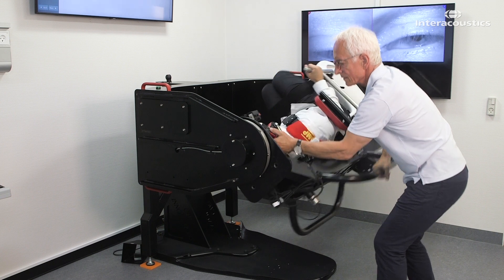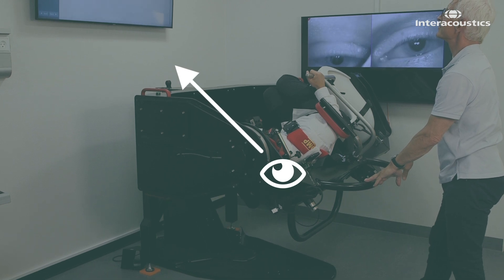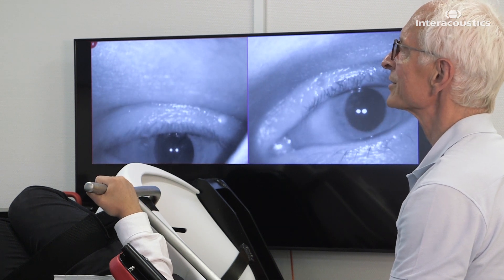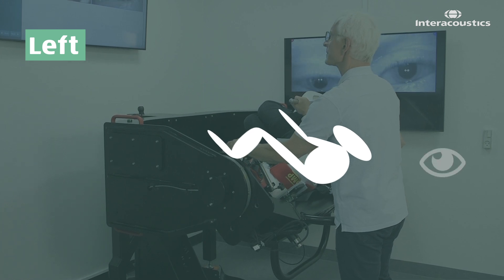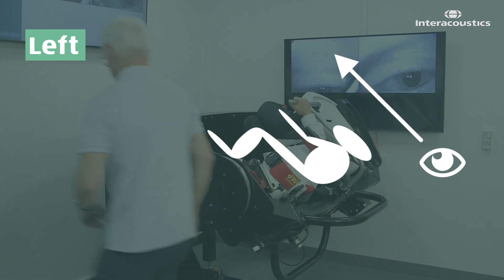Roll the patient arm 45 degrees backwards and lock the secondary arm in position — the patient is facing 45 degrees upward over the healthy ear. If you are treating the left horizontal canal, the head and feet will be pointing in the opposite direction, but the patient is still facing 45 degrees upward over the healthy ear. Hold this position for 30 seconds.